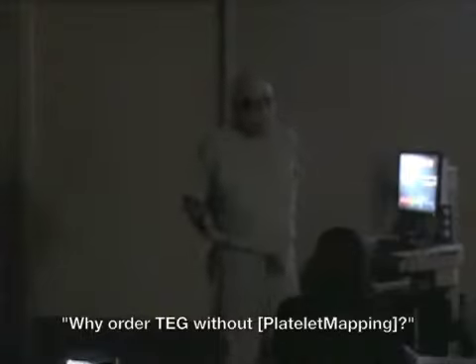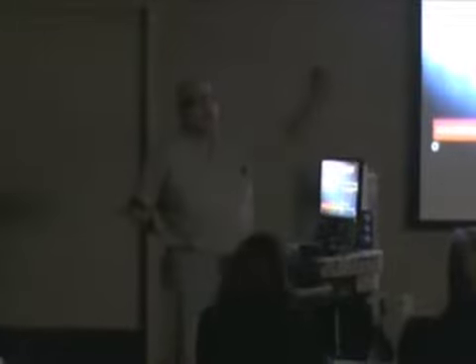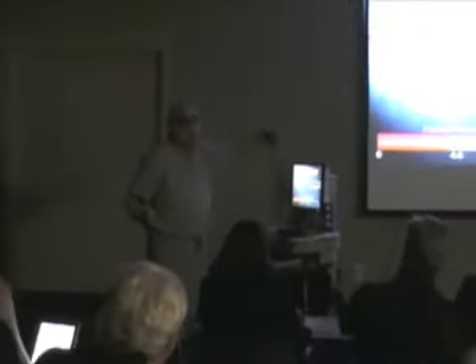So why would you order the TEG without platelet function? Well, it's a good question. Sometimes, if these patients are not on any platelet inhibitors or drugs of that nature, their basic TEG is fine, just to see where they're at to start. If they're hyper to start with, then you need to follow up with them, put them on some inhibition or anticoagulant, depending on where they're hyper: if they're hyper on thrombin, or hyper on platelets, or both.